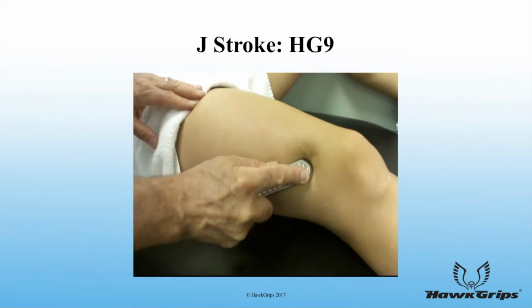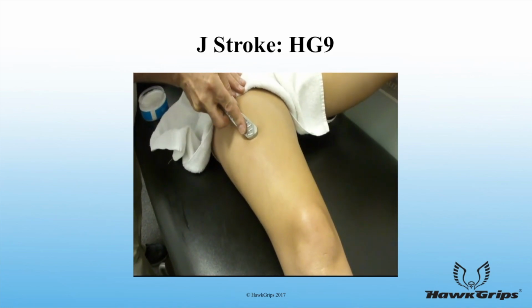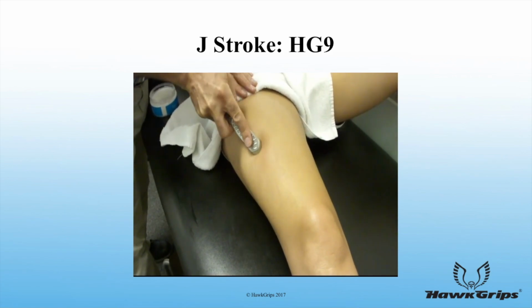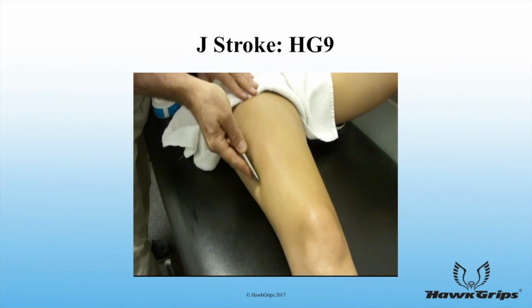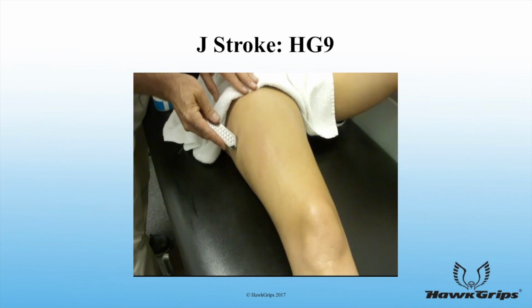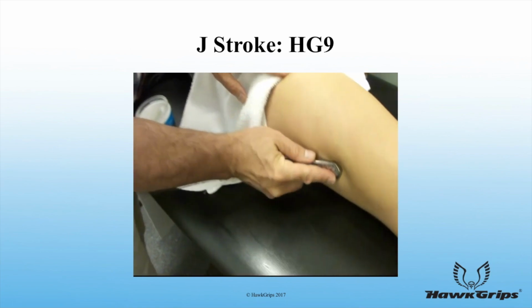Think of this stroke as a brush stroke with a hook on the end. It is important not to keep the instrument flat on the skin while performing the hook motion, but to lift the lateral edge of the instrument as if you were driving a car around a banked turn. This will assist in mobilizing or splaying the target tissue from the adjacent tissue.